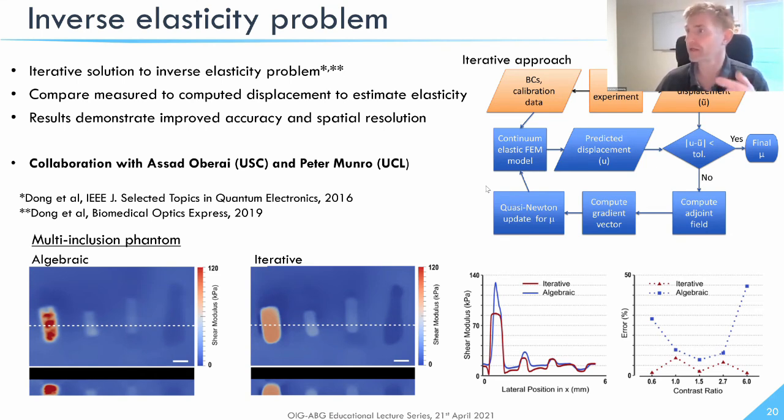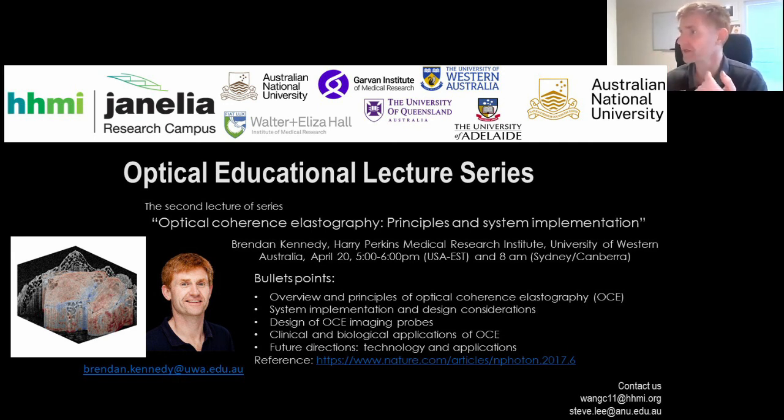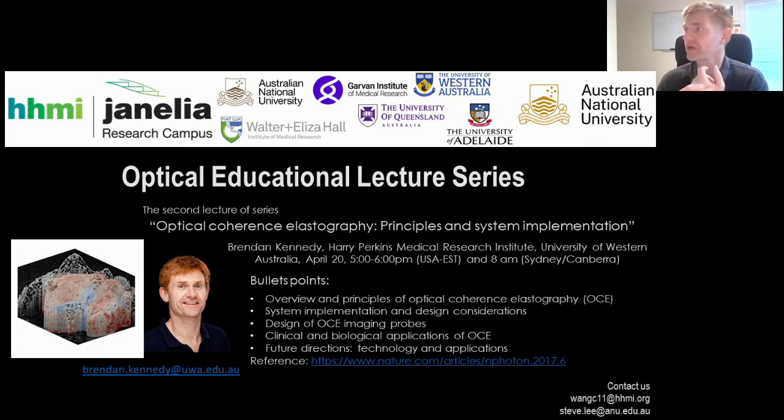We learned from that study how we could adapt the presentation of the data to a reader. And we've started to look at machine learning to crunch through the data to get better results. We strongly feel that the OCT definitely has a role in providing a more robust solution. A large part of it is to map the attenuation coefficient. OCT is a grainy image. It's difficult to see exactly where structures start and end. But if you map the attenuation, that's correlated quite closely with tumor. So we think OCT will have a role.